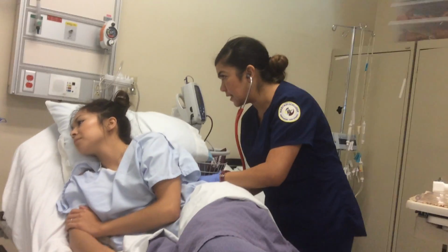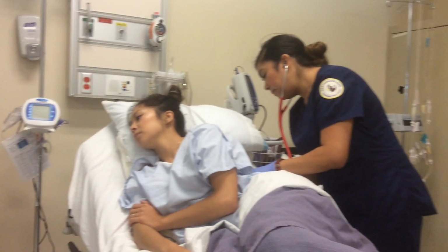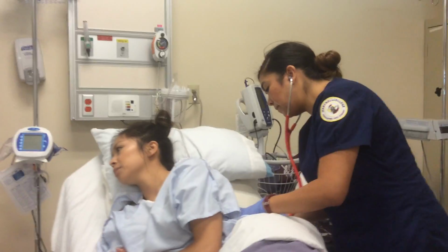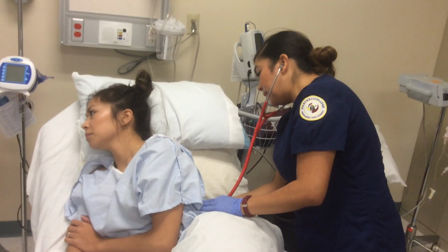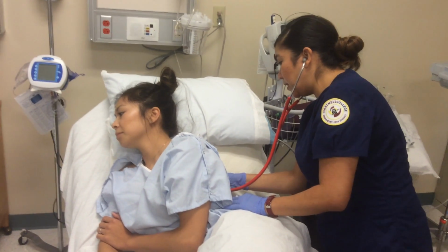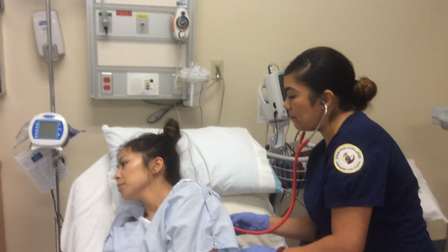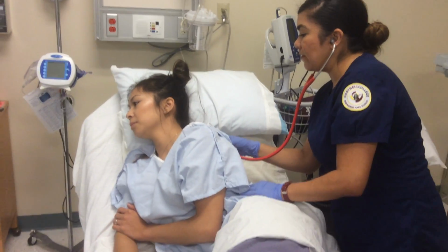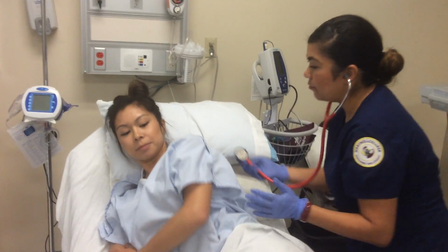When I tell you, if you could just take a deep breath in, okay? Okay, take a deep breath in. Very good. Another one, please. Very good. Another one. Very good. Another one. Very good. Are you doing okay? Another one. Almost there. Go ahead. Okay. Are you feeling dizzy? Okay. Very good. Thank you. Go ahead and roll.